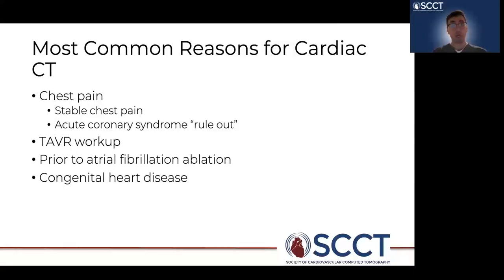What are the most common reasons for cardiac CT? The most common reason is chest pain, and this can be further categorized into stable chest pain or acute coronary syndrome. Stable chest pain, these are usually outpatients. It can be either patients with no history of coronary artery disease or CAD, or patients with known CAD. And the recent guidelines that have come out have put CT more at the forefront of imaging modality in these patients, even with people with known CAD, depending on the location of the disease and how severe it is. So it's a really good tool for many patients, not everyone, but many patients.